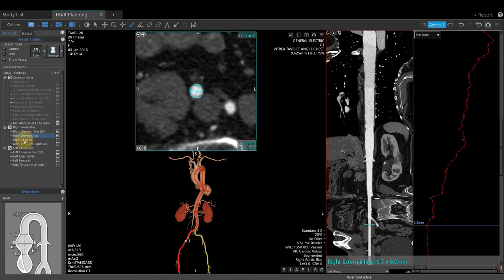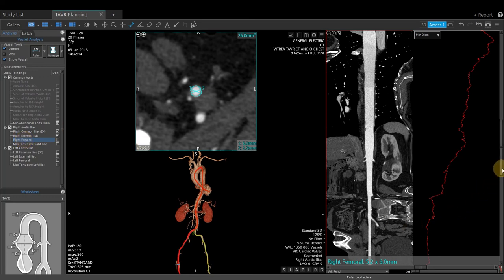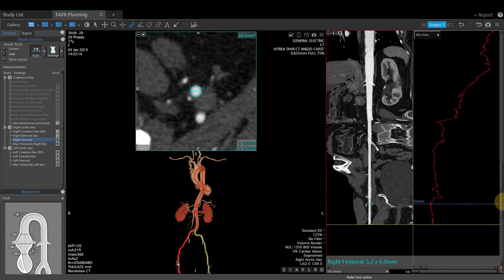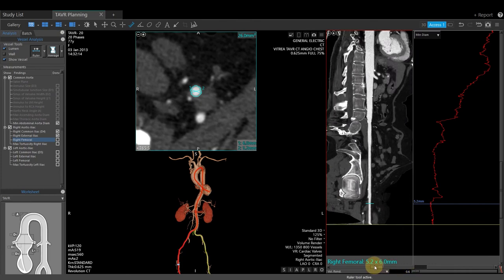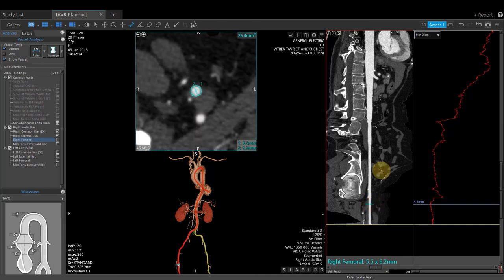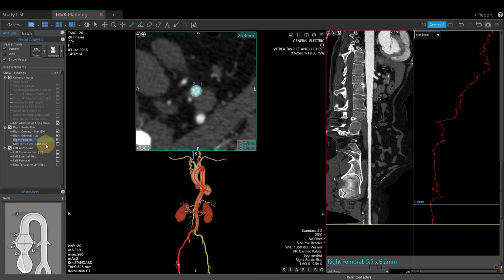Next is the right femoral artery. Left-click to select — the software has automatically measured this. Use the slide bar on the right-hand side to better visualize the vessel, and rotate the image by clicking and dragging. Edit the line the software created if needed, and edit the ruler tool as well when necessary. Click Done to lock this in, then click the snapshot to save. Maximum tortuosity is typically not created anymore, so that measurement will be skipped.